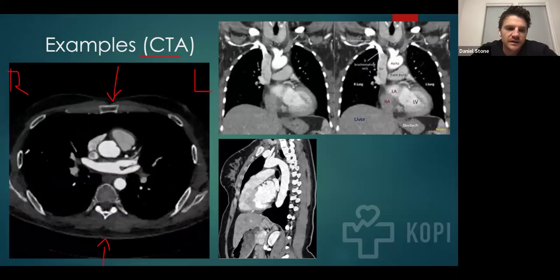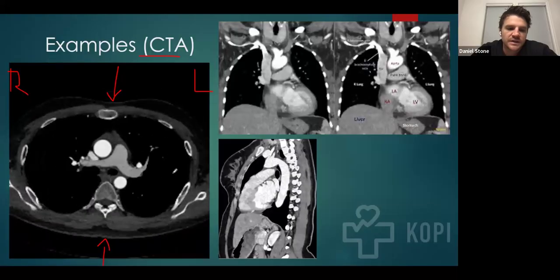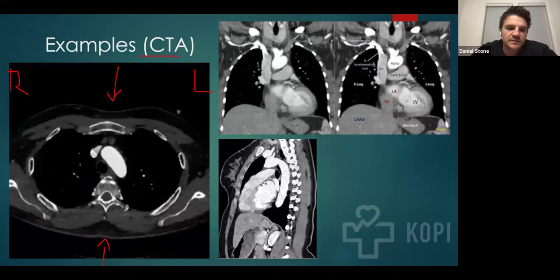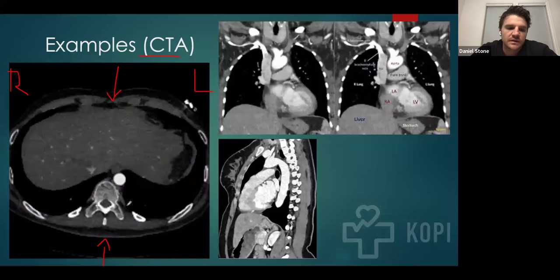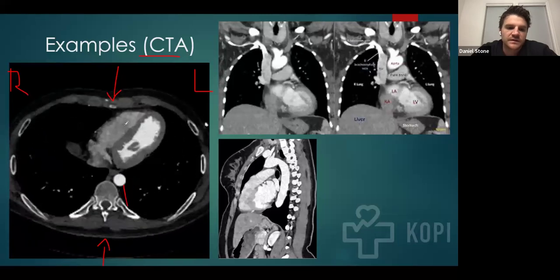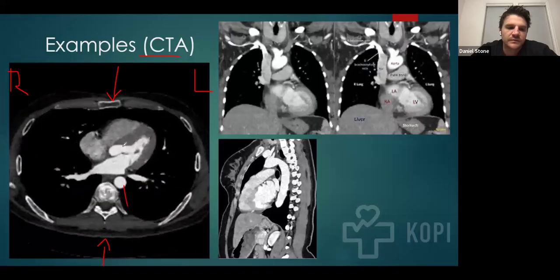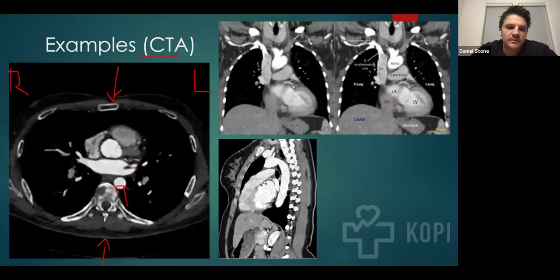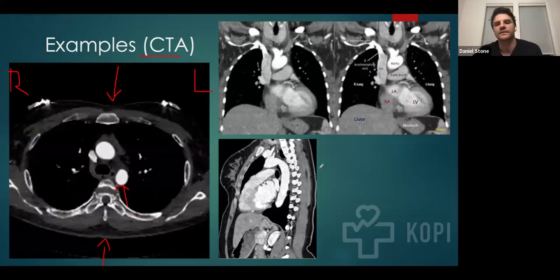You can see the liver down there at the bottom, towards the end of the projection, and then you can see the spleen on the left. It's a very good example of what a normal CTA looks like. The aorta is normal caliber. The pulmonary vessels are seen with a little bit of contrast in them, but the timing is clearly aortic, to basically evaluate for any aortic pathology.